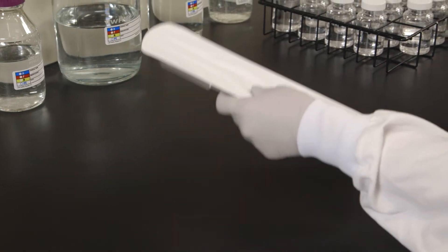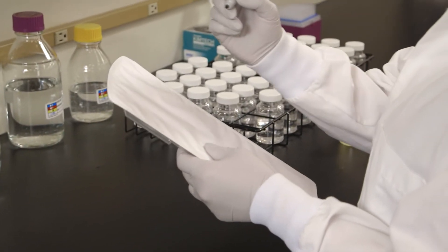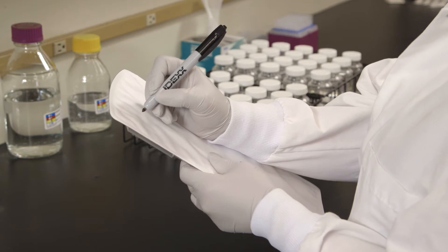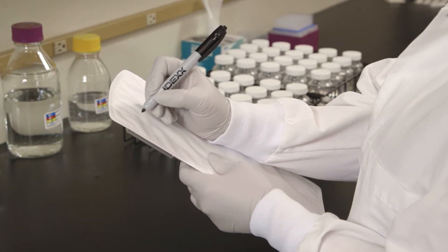Use only a permanent felt tip marker to label the LegiAlert Quantitray. Adhesive labels may adhere to the sealer roller and ballpoint pens may puncture the paper.